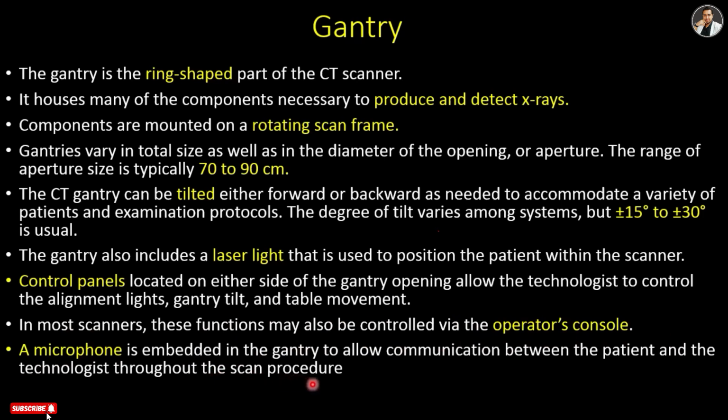There is a microphone attached to the gantry. When the patient talks, we can hear the patient's speech. And when we talk, the patient can hear our speech.